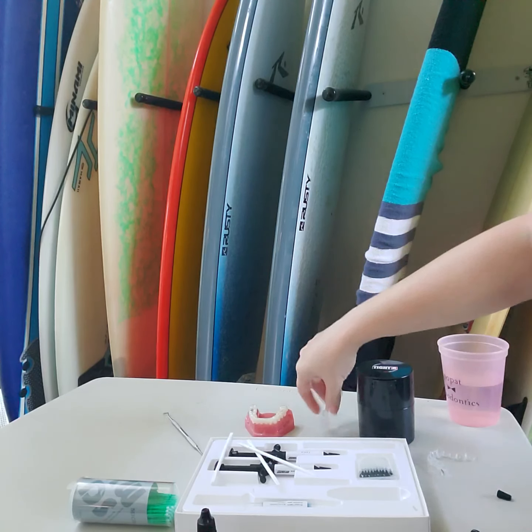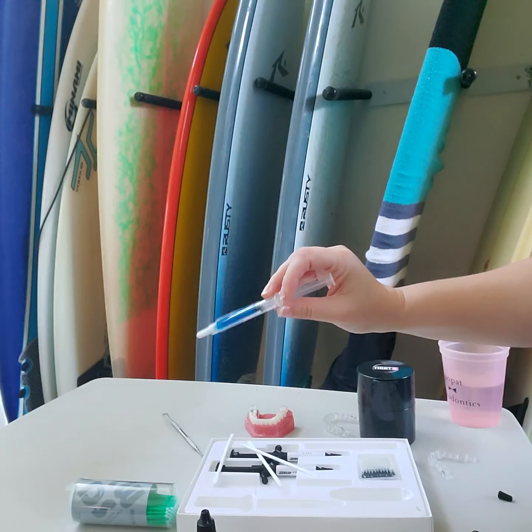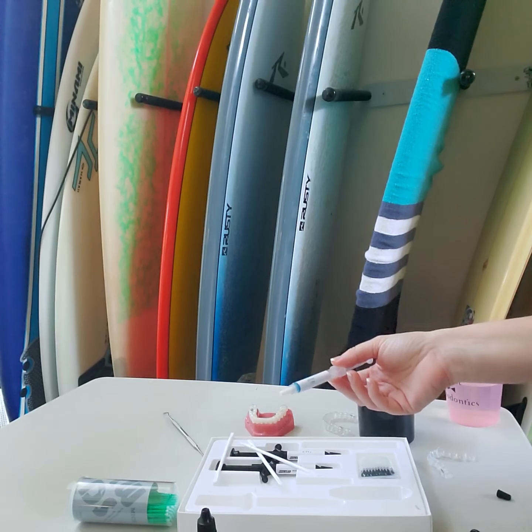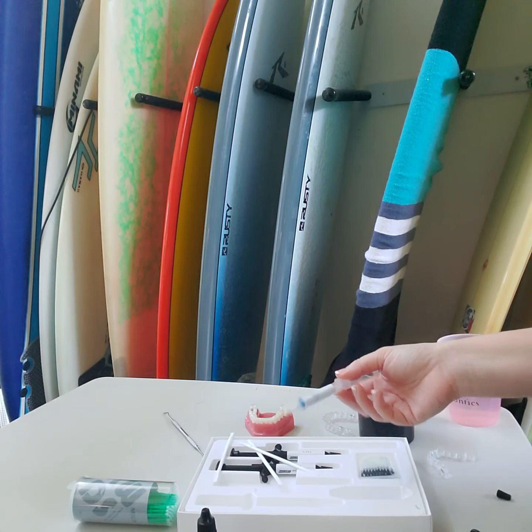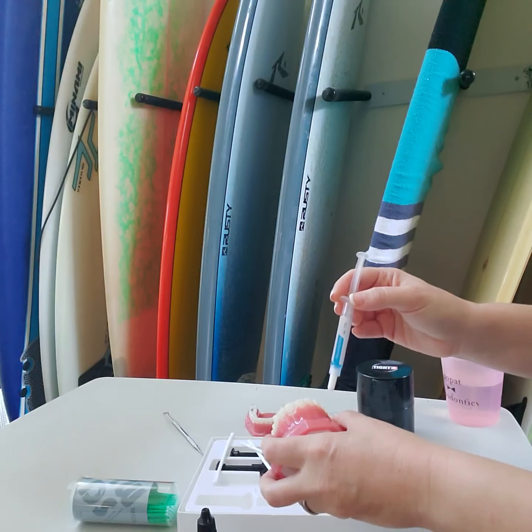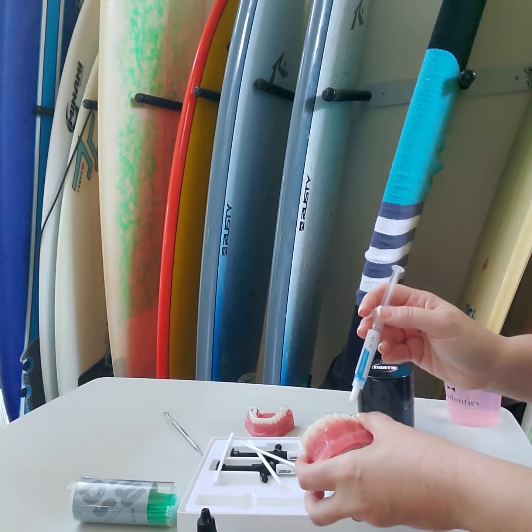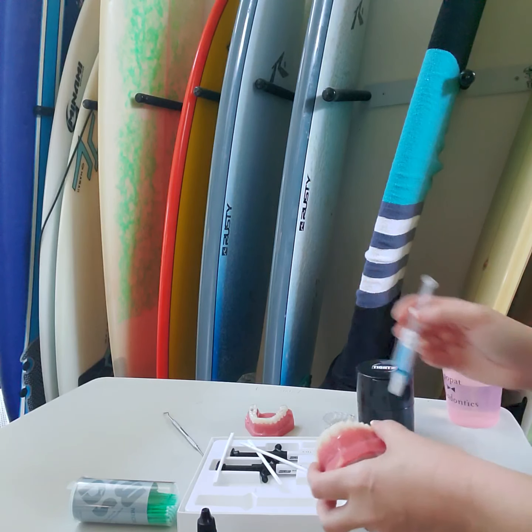You're going to go ahead, right? Remember your basic etching skills. You're going to use your blue or green etch, okay? You're going to leave it on for 15, 20 seconds. You're going to rinse thoroughly. Then you only need to etch the area of the actual attachment. So you need to look at the map and be like, I need one here and here and here and here and here and here, you know.